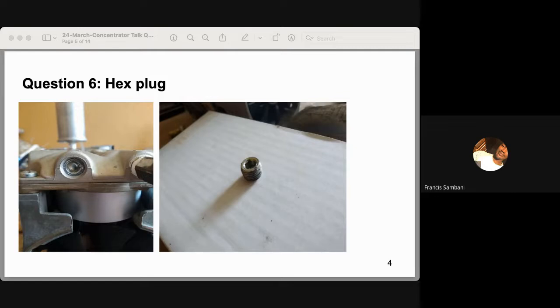If you find that the pressure value you got is much less than that in the performance chart, it means that you should replace the worn-out service kits of the compressor. Namely, you have sleeves, components that wear out inside the compressor. You have the stainless sleeves, the caps, and the O-rings or gaskets. It might not be that you need to replace all of them at once, but only the ones that are worn out. You can physically check that. If it is the caps and the sleeves that are worn out, you replace those.